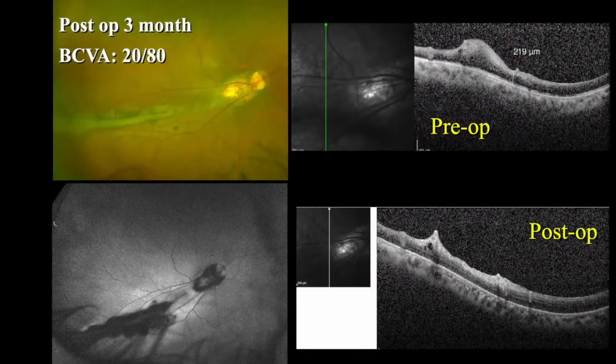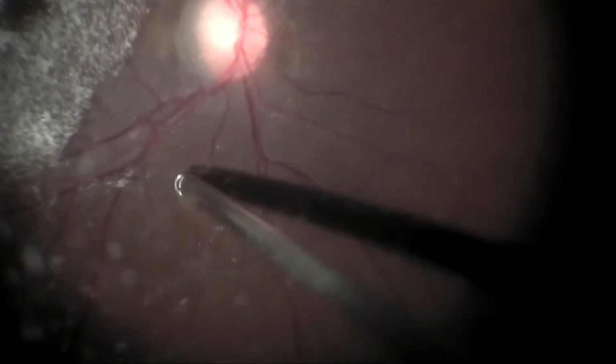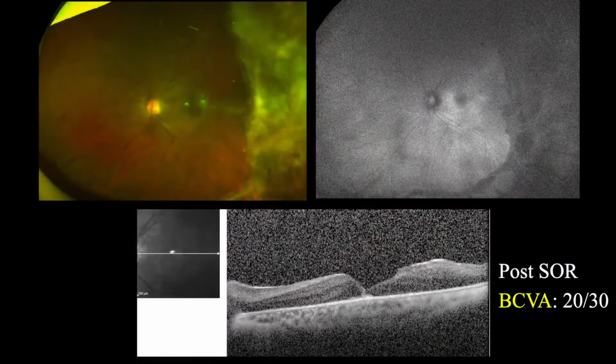After 3 months of surgery, the fold at the macular area was narrowed down and almost flattened. Vision improved to 20/80. Left eye retinal detachment was treated with vitrectomy, PVD induction, internal drainage, barraging all lattices and breaks, and silicone oil endotamponade. Post-operatively, final vision improved to 20/30 after removal of silicone oil in this eye.